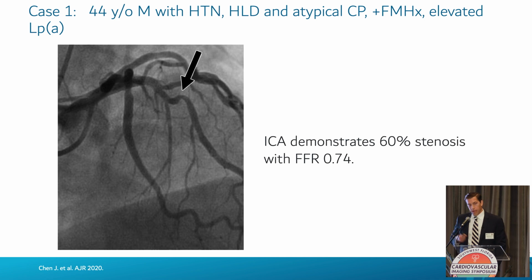So I think this very simple case highlights the value of FFR for sometimes adjudicating some of these intermediate stenoses, in the setting of suboptimal image quality. So sometimes when there's mild to moderate artifacts, FFR can be very helpful, leaning one direction or the other.